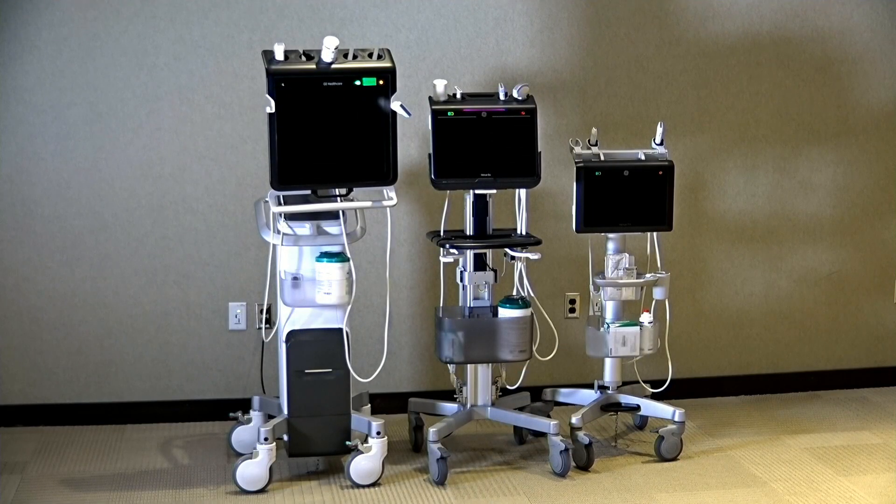Probes are located at the top of the systems, so the cables never touch the ground, even when the system is at its lowest height. This keeps the probes and cords safe, secure, and clean.